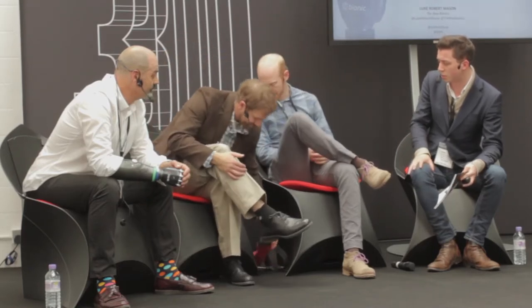Now, some of the challenges which we spoke about with regards to these prosthetic limbs is that they may break. Now, I know that advances in materials such as flexi materials are changing that. And I know that, Jeff, I think you have the flexi arm with you to demonstrate. So again, the challenge for a lot of the Enable community is the fact that these gentlemen 3D print these limbs, they ship them off, they turn up snapped or broken because of the brittleness of the material.